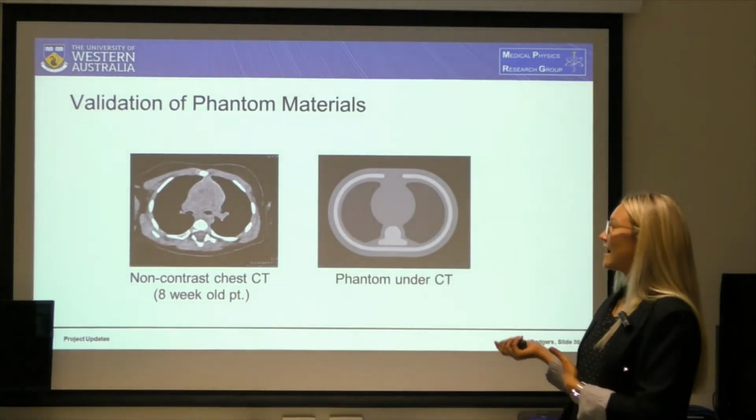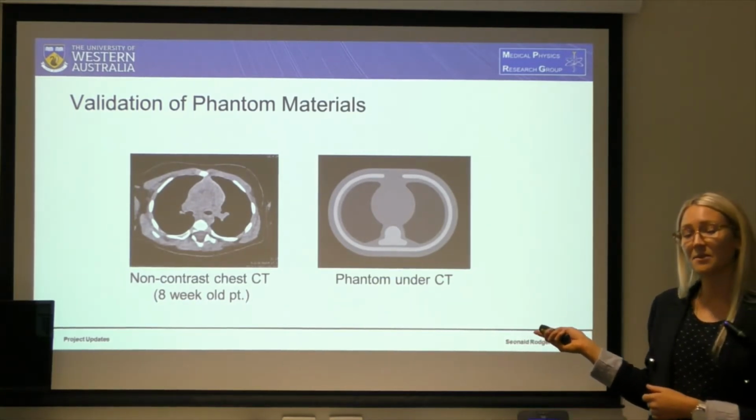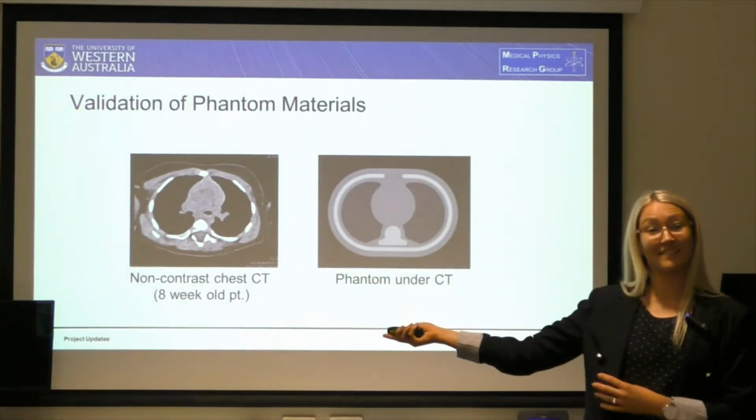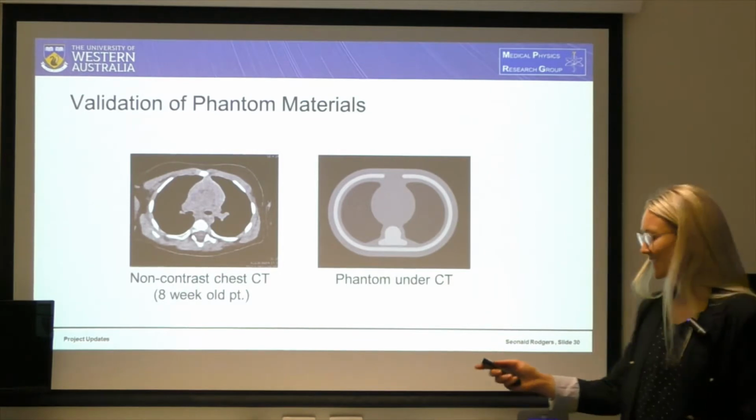So this is my Phantom, scanned under CT to look at the tissue substitute materials compared to a real patient about the right age that we're looking at. So this is my baby.